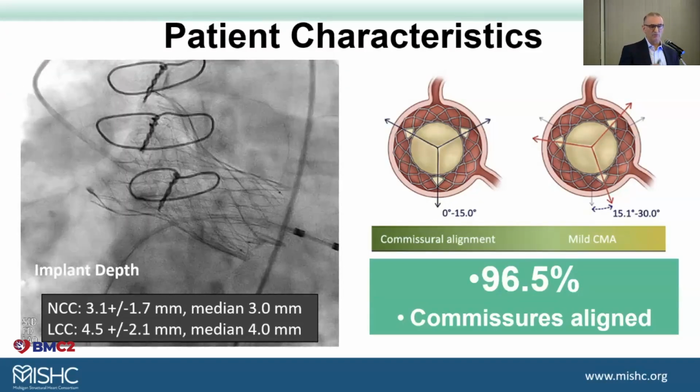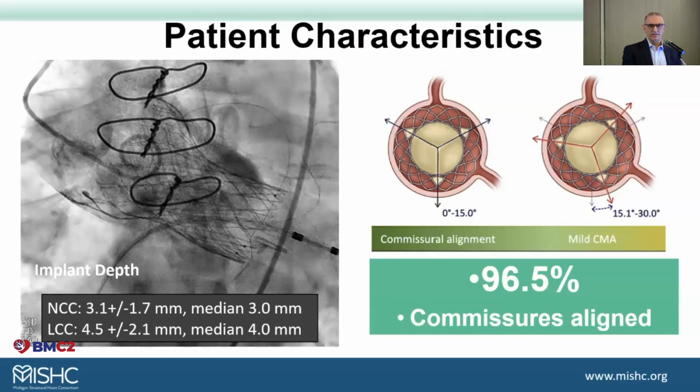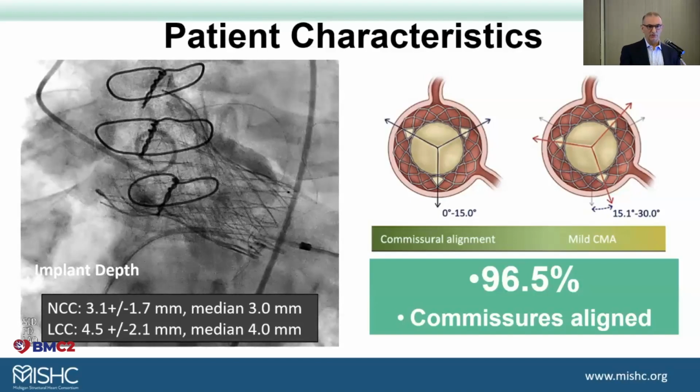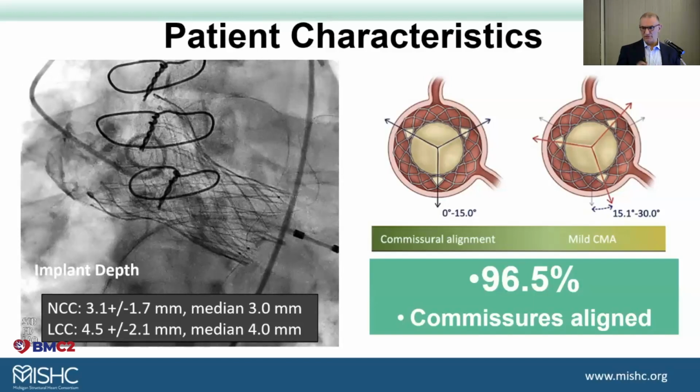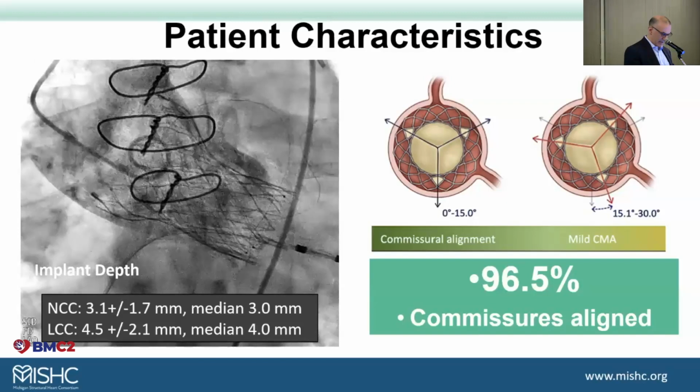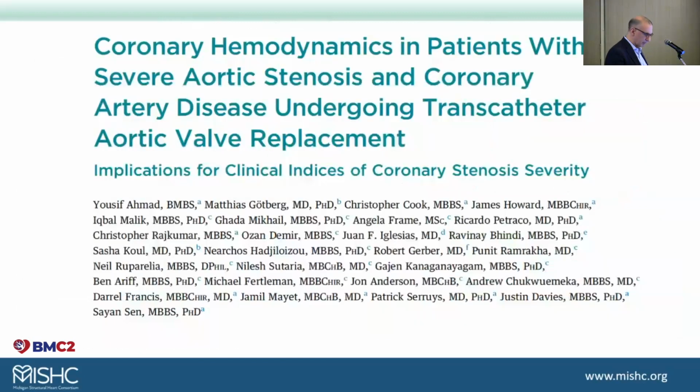And what's even more reassuring is that using these 4 techniques, I just came from a week in Japan, and they did the same thing in the Little Japan registry, and they have achieved commissure alignment in Japan in 97% of cases. So this is a technique that is reproducible across the world.